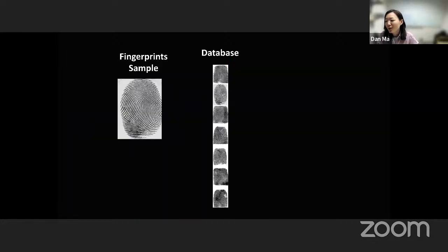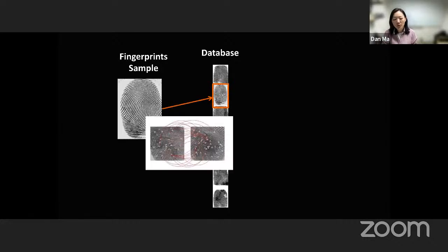Why we call it MR fingerprinting is because the basic underlying concept is similar to the actual fingerprinting technology. Once you have a fingerprint, it doesn't matter what this fingerprint looks like. If you have a comprehensive database, you can use some matching technology to find this fingerprint from the database. And once this fingerprint is identified, a whole list of information related to that person can be extracted simultaneously. We don't need to find the name first and then the phone number next. Everything is stored and linked to the unique fingerprint.